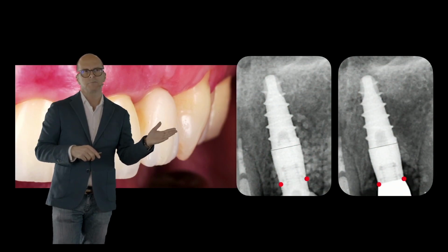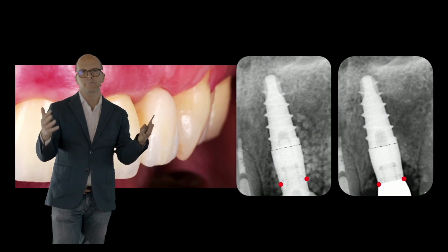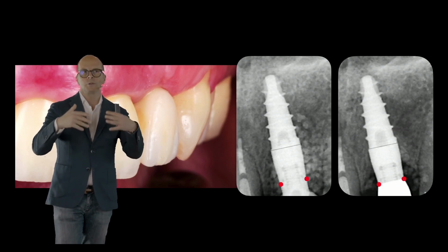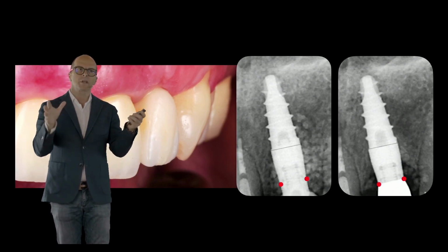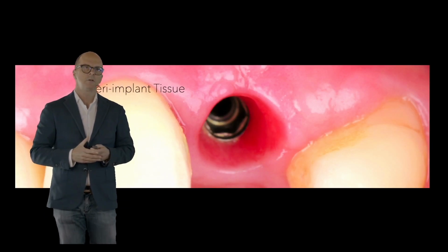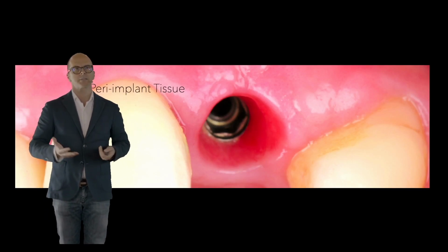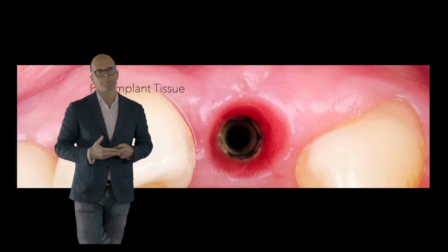This is what we achieve after the implant placement. The day 0 and then after a few months. Where we have a space-maintaining defect, the bone is going to grow around the neck of the implant. So we have osseointegration. Where we don't have a space-maintaining defect, we have the connective tissue going around the implant. What we achieve is a nice peri-implant tissue without any huge surgical approach, without GBR or other techniques to develop the site. So in a way, we're reaching a final outcome with a very minimally invasive approach.